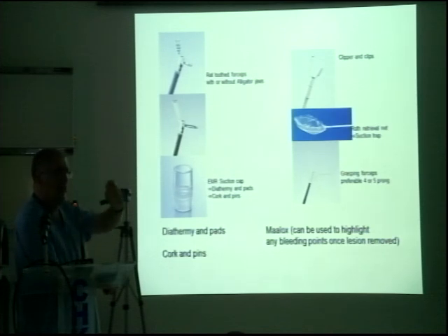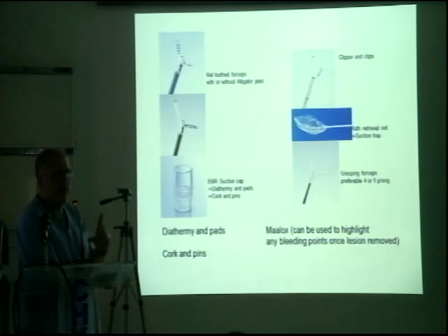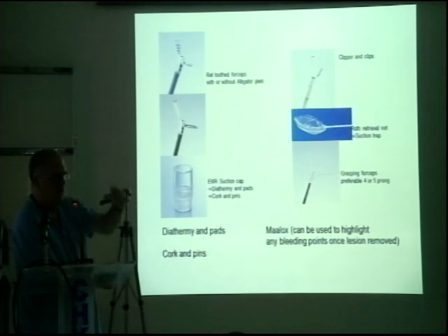I'll then slide the snare out and guide the actual thing over myself. Because when you ask this member of staff to open the snare slowly, the snare is open. When you ask them to close the snare slowly, the polyp is off. So when you actually ask them to do something, I say, I'm going to ask you to slowly close the snare, and I want it closed at this rate. So be very prescriptive.